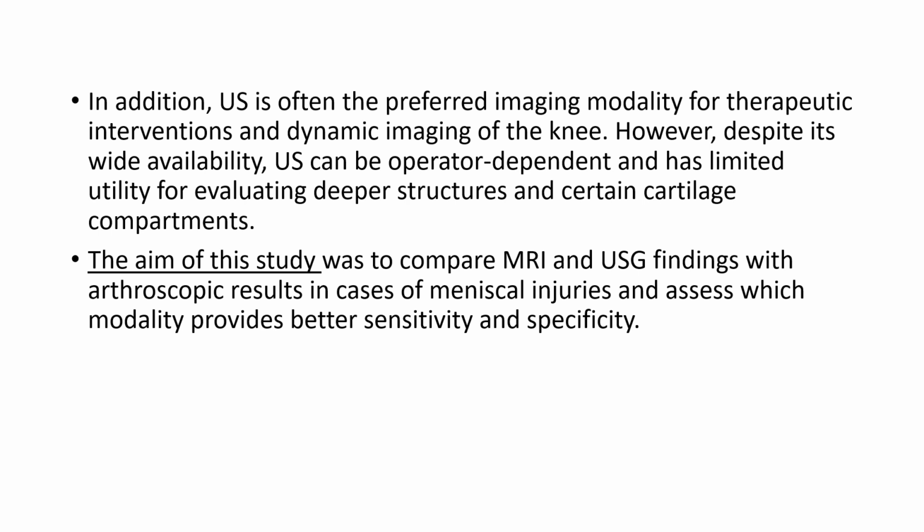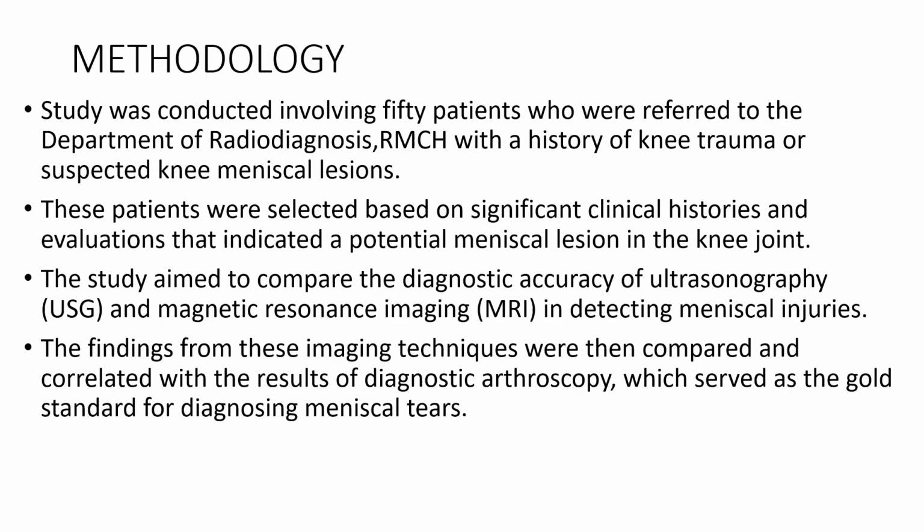In addition, ultrasound is often the preferred imaging modality for therapeutic intervention and dynamic imaging of the knee. However, despite its wide availability, it is operator dependent and has limited utility for evaluating deeper structures and certain cartilage compartments. The aim of this study was to compare these two modalities, MRI and USG, with arthroscopic results in cases of meniscal injuries and assess which modality provides a better sensitivity and specificity.